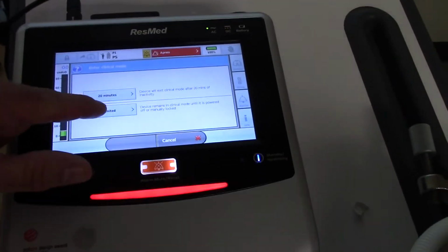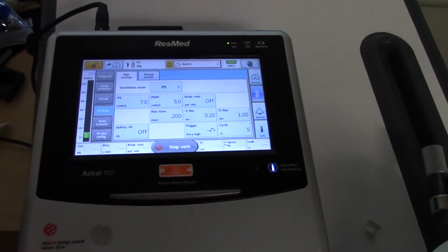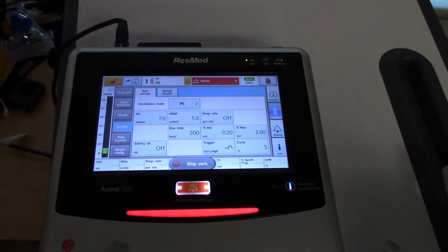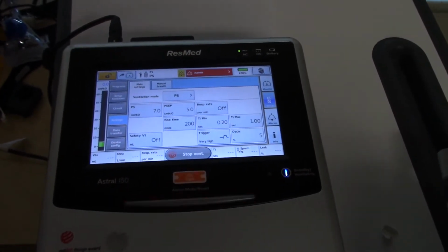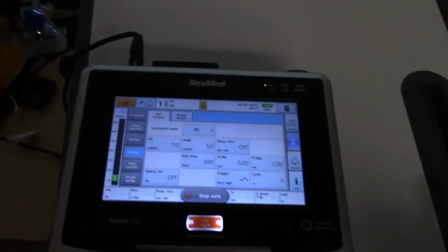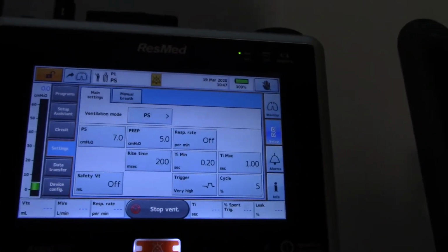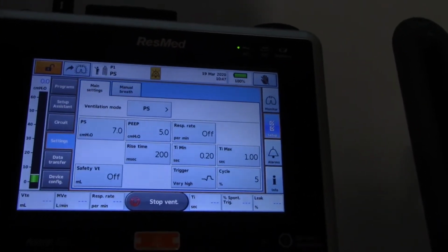You want to hit unlimited. That gives you access to changing all the settings. And every time you turn the vent off and on, you're going to have to do that again. You're going to have to go to unlimited because it resets when you turn it off. Okay, so now you're in the setting section of the vent.